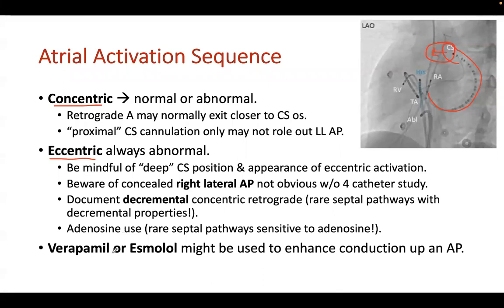Okay. So in pediatrics especially, I usually like to do adenosine. We sometimes use these meds, but in adults you are less likely to do these tricks. But once in a while, when it's a difficult case, it's nice to know these tricks so that you clarify the diagnosis.